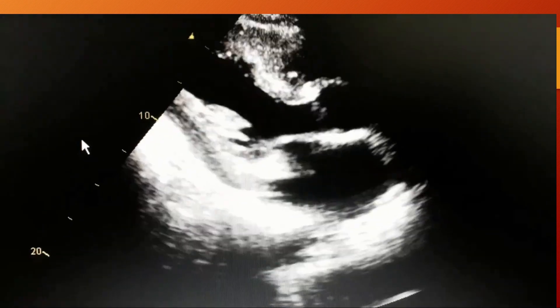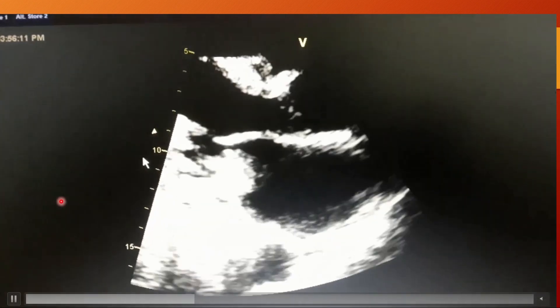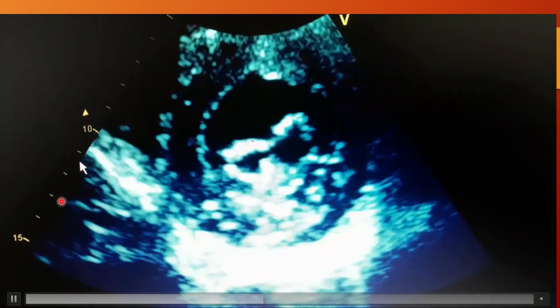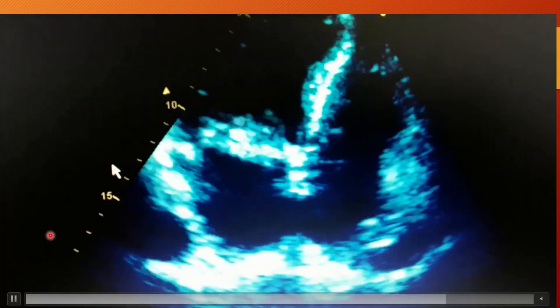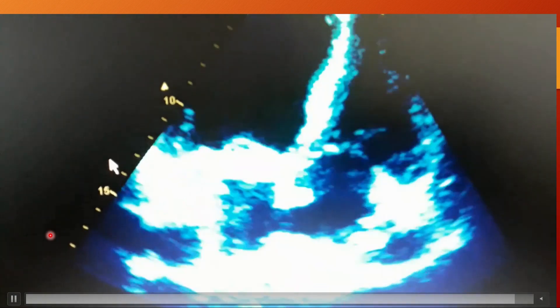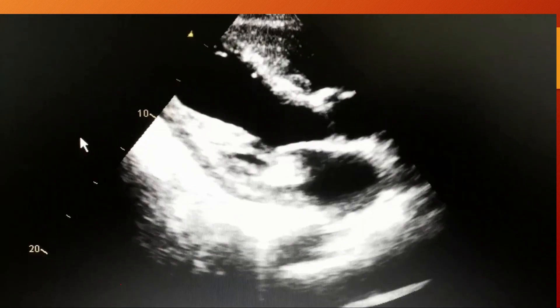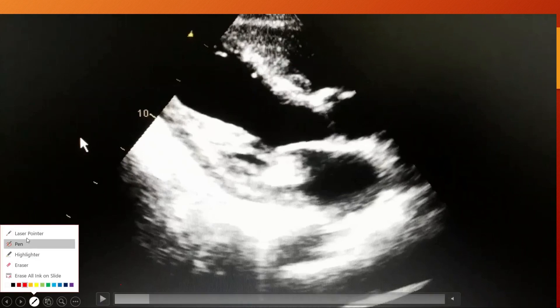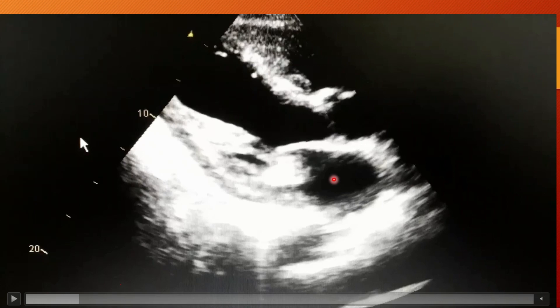So this is the echo which we will be discussing today. Let's begin the discussion on this study. First of all, the views — as you can see, the first view here is the parasternal long axis view, as I explained in detail in the basics of echo video.